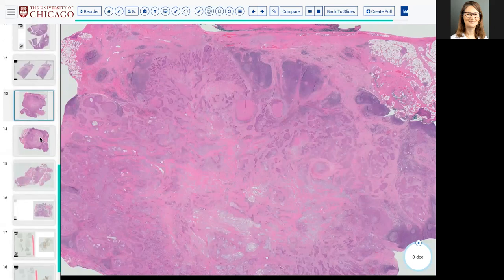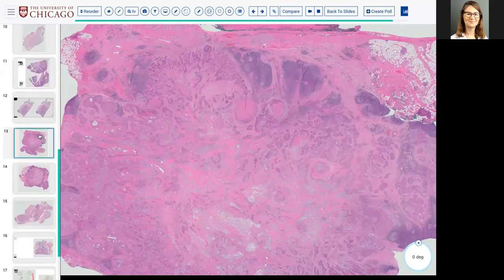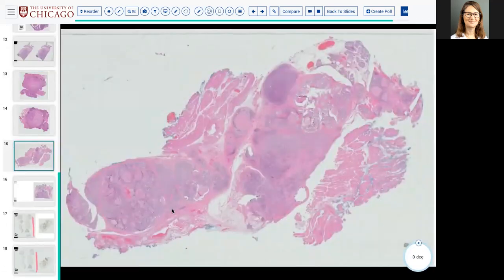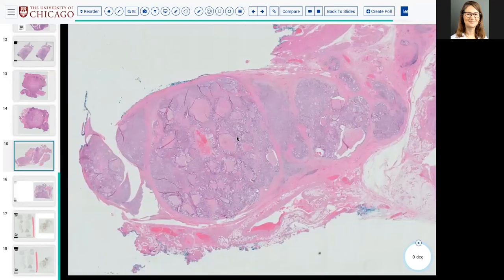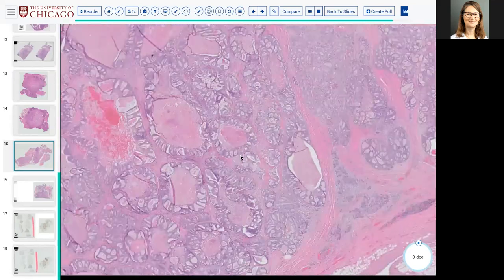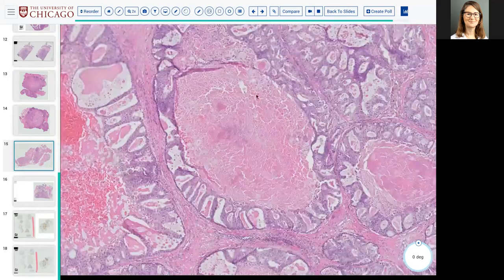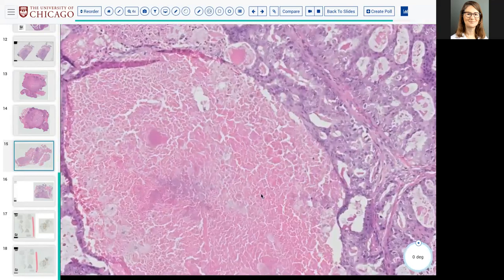Yeah. So I think there's an important distinction to be made between intraductal carcinoma, salivary duct carcinoma, and high-grade carcinoma of salivary origin with necrosis. I'm just showing you this in contrast, where you have islands, right? You have islands with central necrosis.